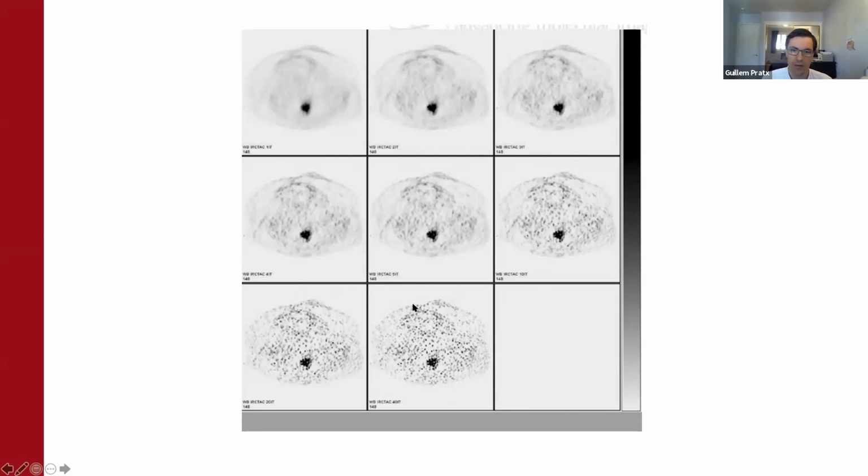And so there's a trade-off when we run an iterative method between getting sharp details to come in focus and controlling noise, right? Depending on the goal of the imaging and the reconstruction, the number of iterations may be different. So there's really no single answer to what's the optimal number of iterations for a given algorithm. It depends on the data set, and it depends on the task for which the images are being used.